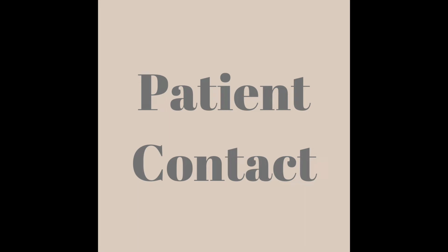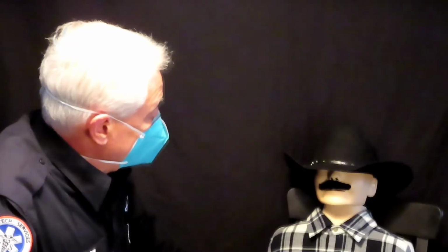Patient contact. Hi, my name is Don. I'm an EMT. I'm going to help you. If appropriate, place the patient in a high Fowler position and obtain a complete set of vitals, including SpO2. Then assess the patient for lung sounds.